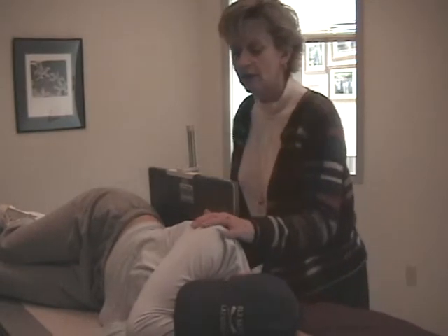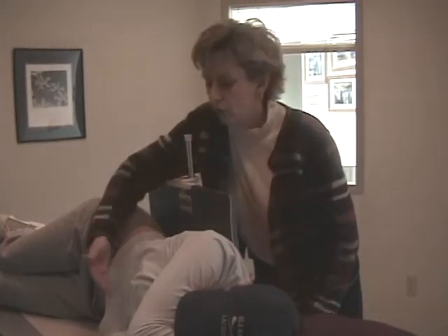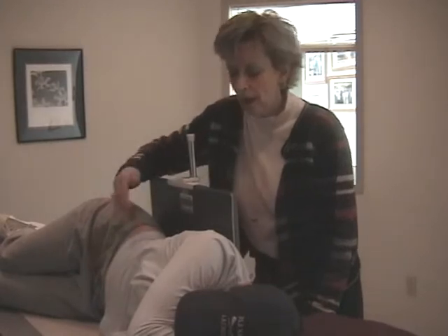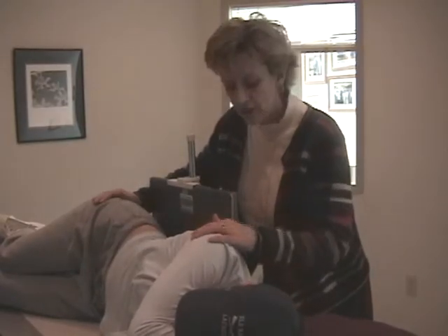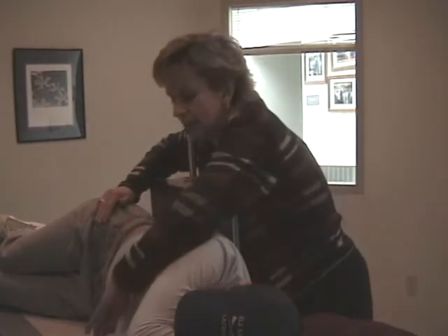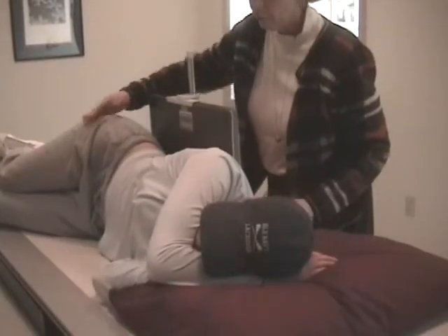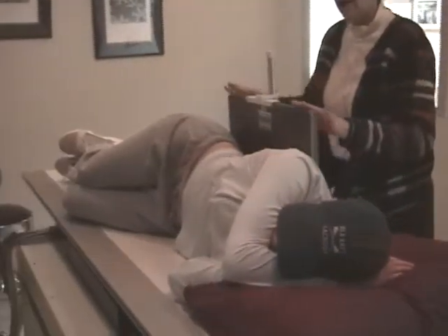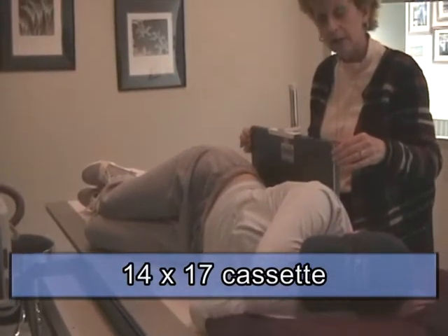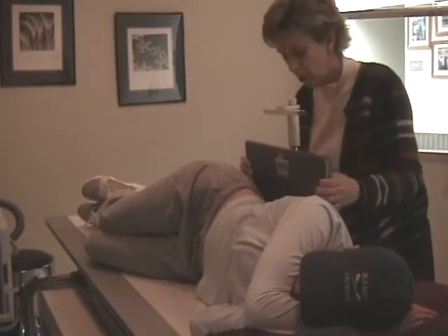The patient's on her left side. Again, that's to trap the air of the stomach down so free air can rise. And she's in a true lateral position. Check her shoulders, check her back. Arms need to be up, clearing the abdomen, and her head is resting comfortably on the table. I have a 14 by 17 cassette with a grid, a portable grid placed in front of it. And I'm going to show you how I place the markers here.